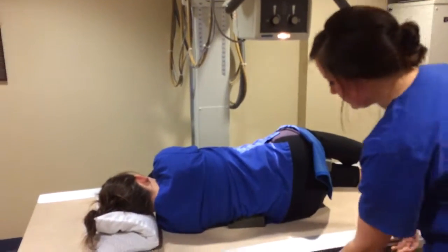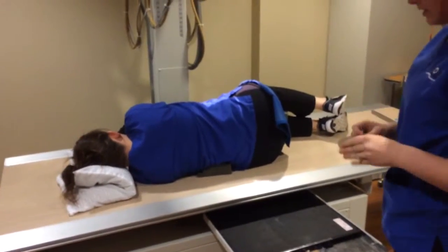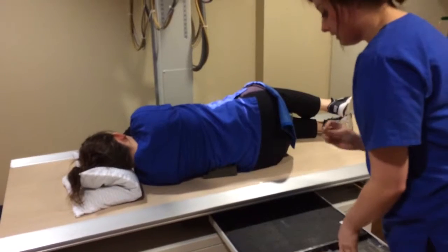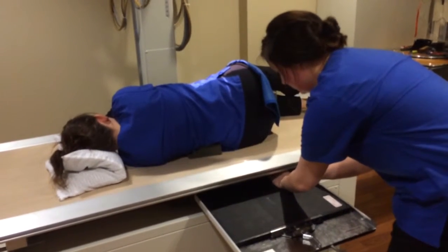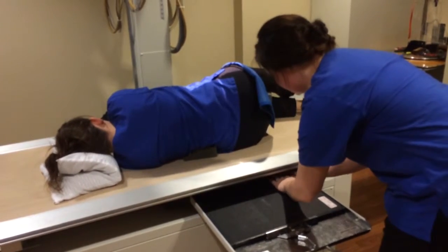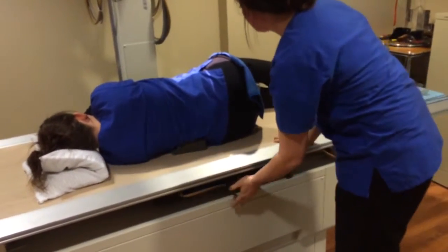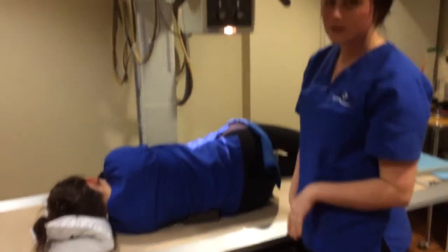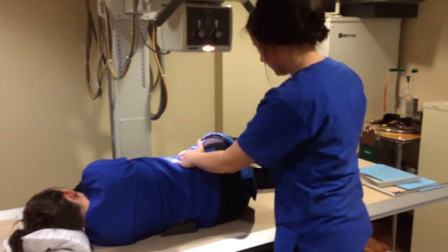I am going to switch out my image receptor. I'm going to take the left marker and put it about 3 inches in, and it will be anterior to my patient. And I am going to then again center at the iliac crest right here.